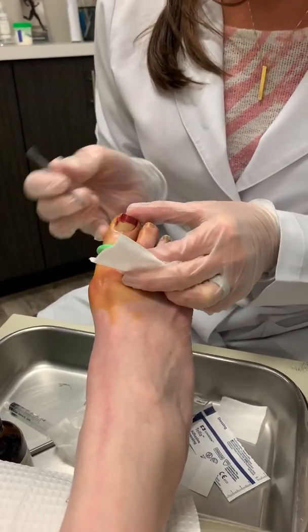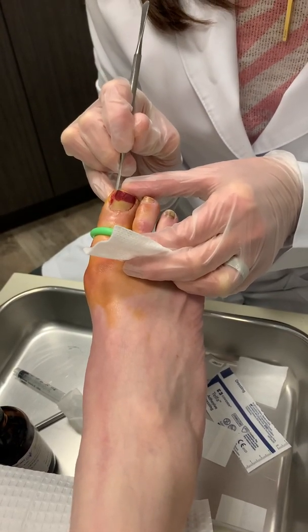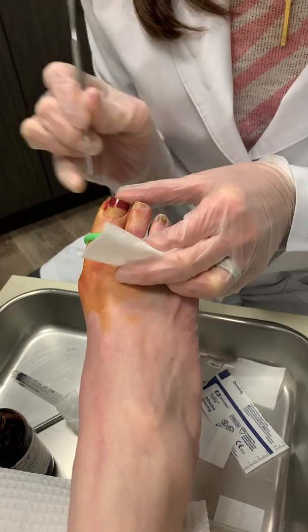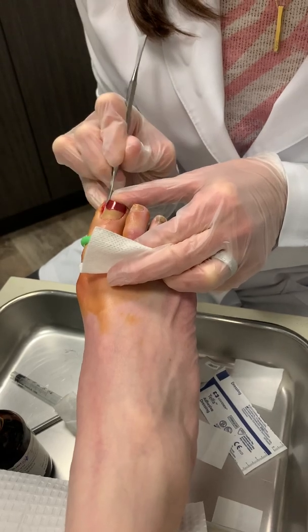The first step is you use a little instrument called a spatula, and we'll just slide down this edge of nail. The patient should feel pressure and the toe move, but shouldn't feel anything sharp. Do you feel anything sharp? So you just put the little spatula down the edge.